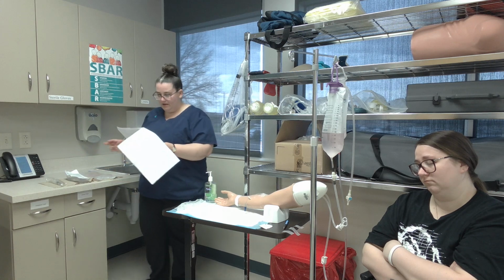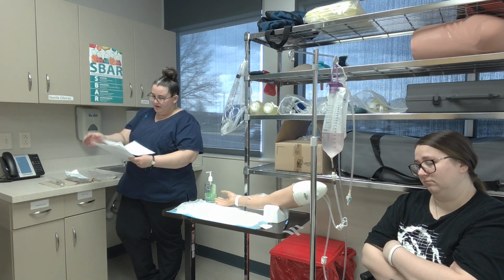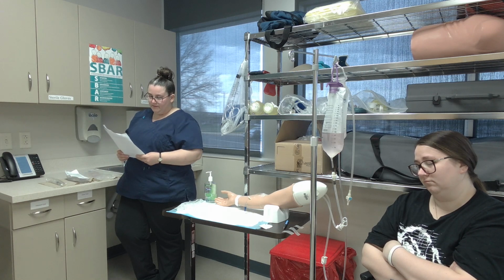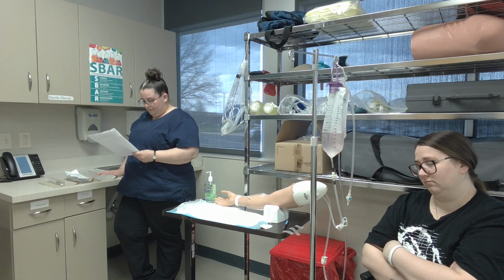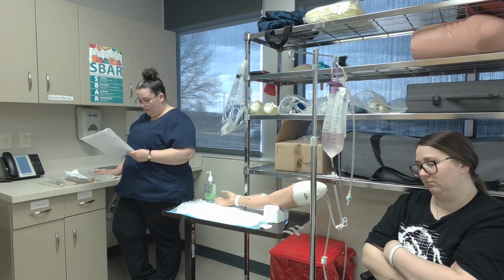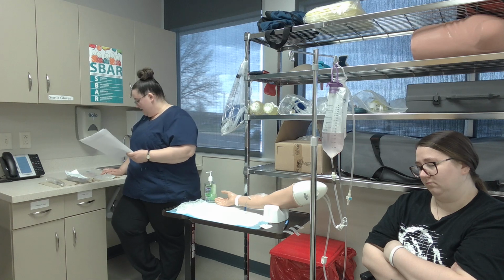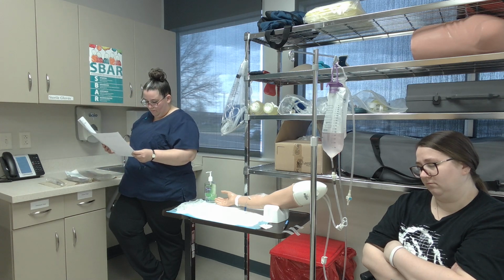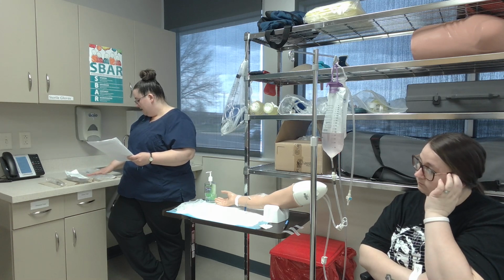For my second med check, my second medication for Mr. Joseph Smith, date of birth 10/5/1954. 0.9% normal saline, 1,000 ml IV continuous infusion, 100 ml per hour, 25 drops per minute, and no crystallization.